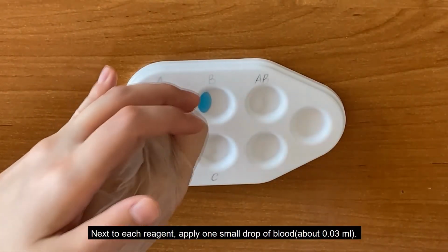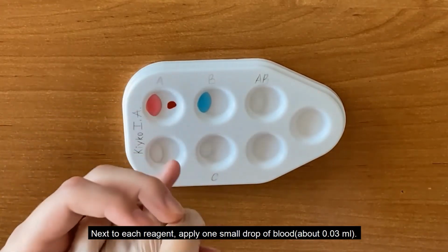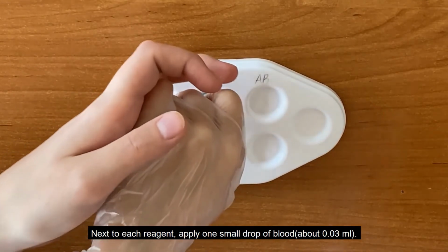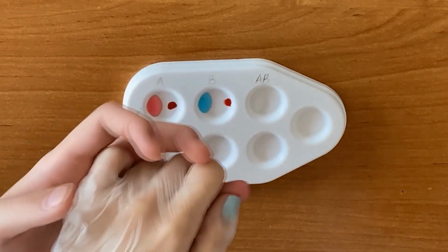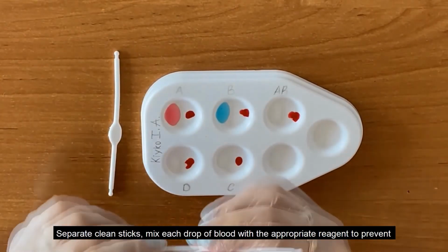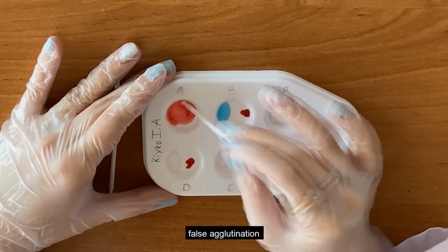Next to each reagent, apply one small drop of blood, about 0.03 milliliter. Separate clean sticks. Mix each drop of blood with the appropriate reagent to prevent false agglutination.